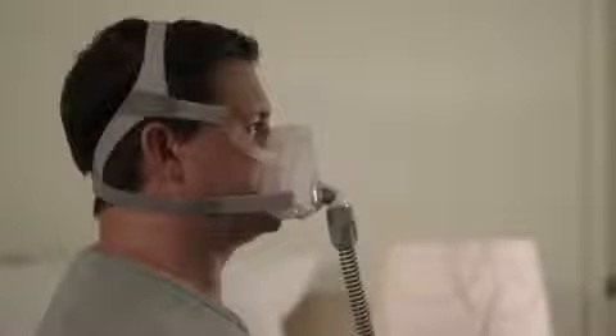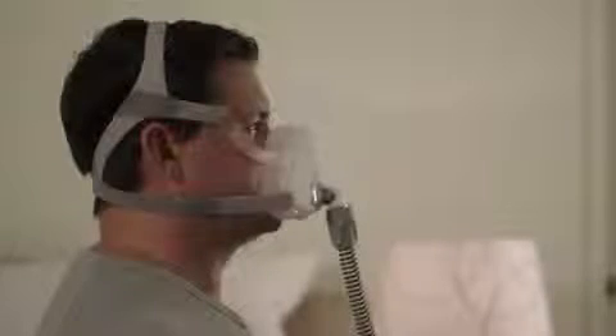Remember that the AirFit F10's cushion sits from the crease of the chin, and at the top it's designed to touch your nose around here. The straps shouldn't touch your ears. Now lie down to make any final adjustments if required, and your mask is ready to use.